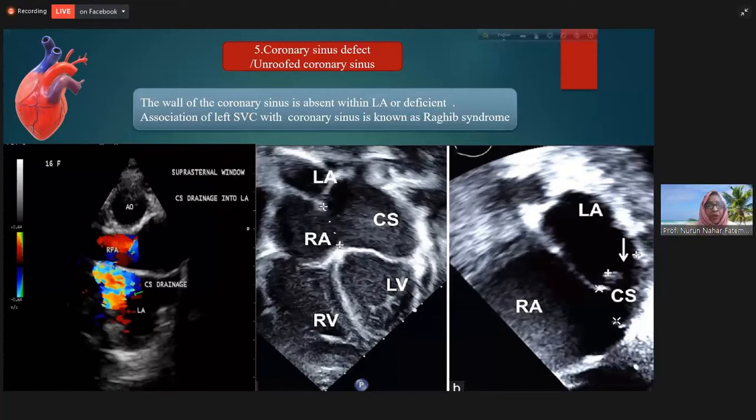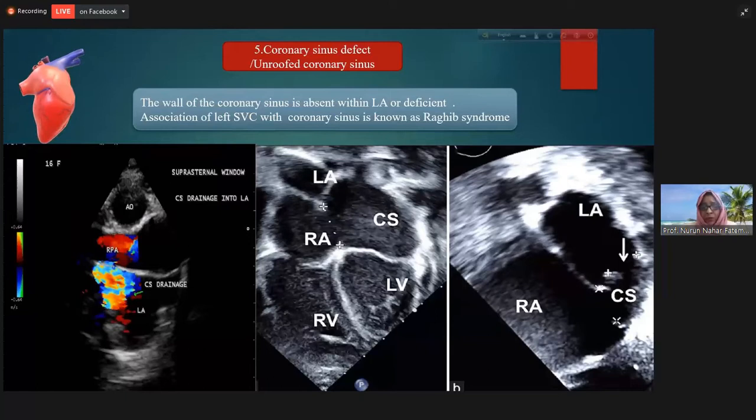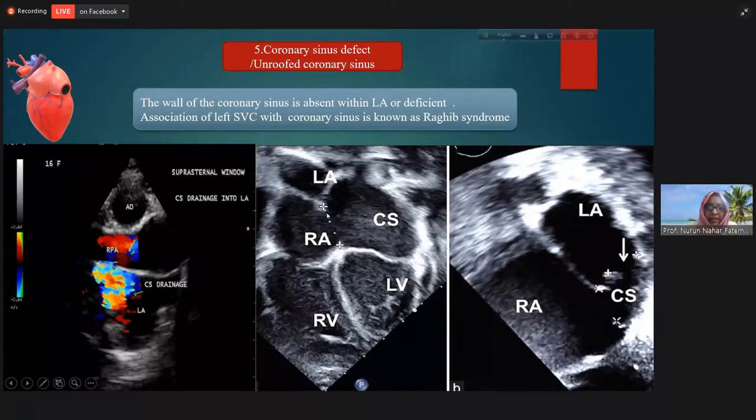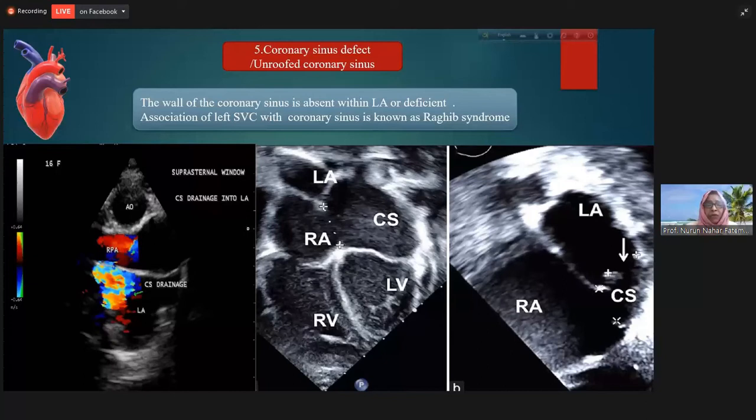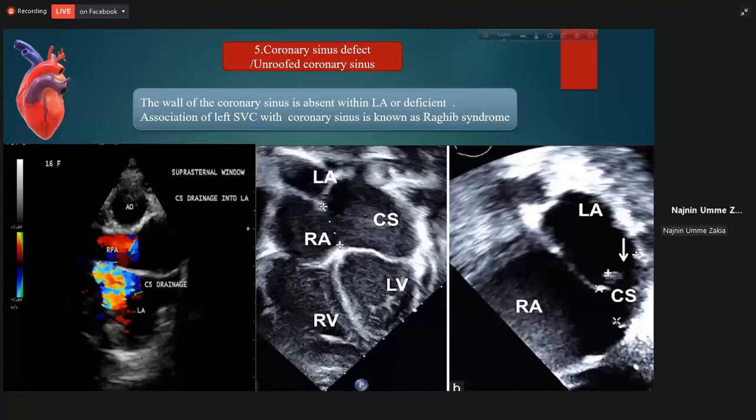Another variety is the unroofed coronary sinus. The wall of the coronary sinus is absent within the left atrium or may be deficient. You can see a dilated coronary sinus here, and there is a defect with left atrium due to absence of the roof of the coronary sinus. If this is associated with persistence of a left-sided superior vena cava, we call it Raghib syndrome.